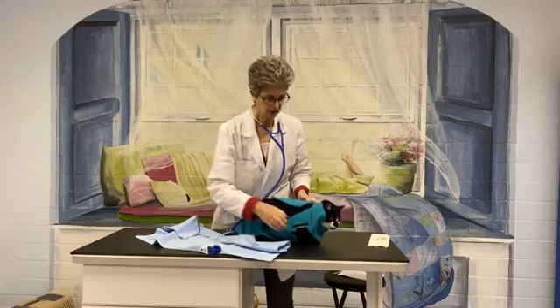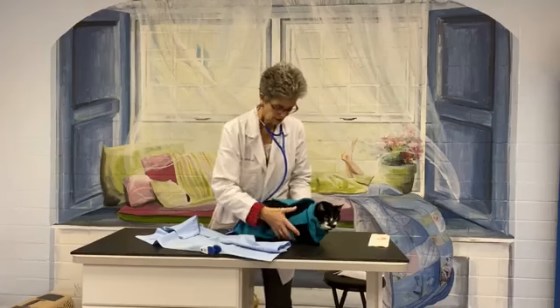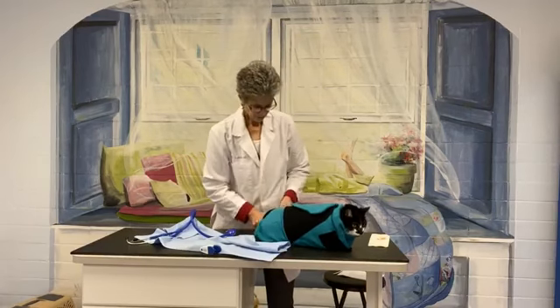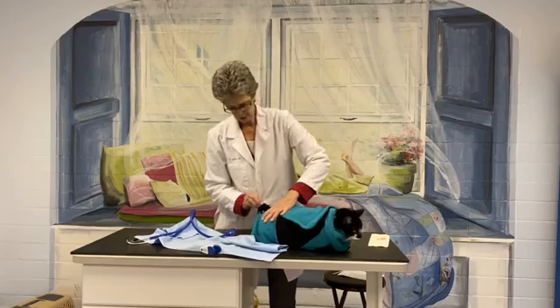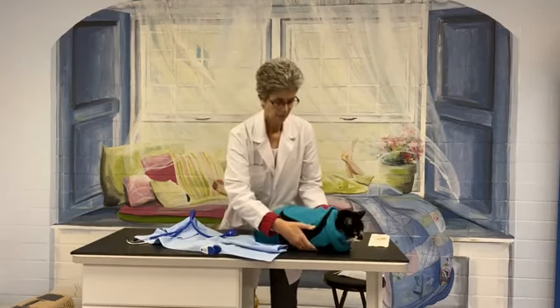Now, Banks does not like to have his head covered very much, so that's part of why he's growling like that. Some of the other things that are nice about this product is we have points here that we can open up for a lumbar injection.